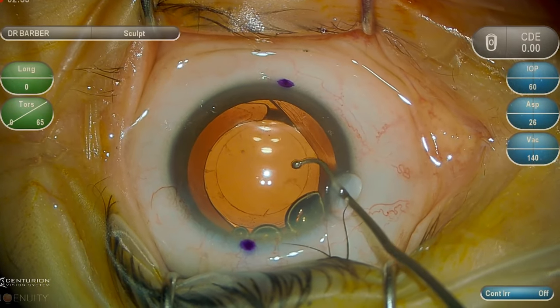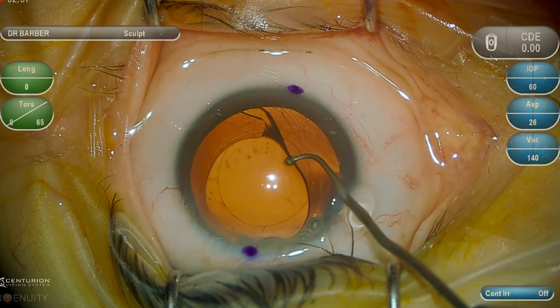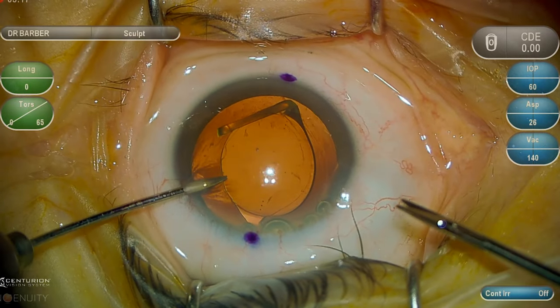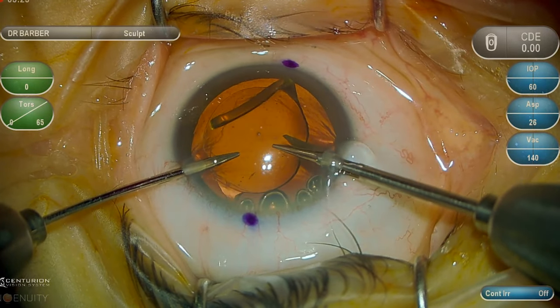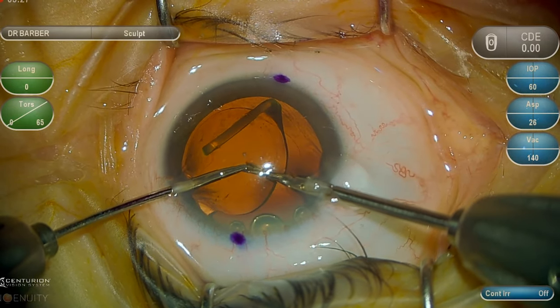Once adequate viscoelastic has been injected both posterior and anterior to the lens implant, the lens implant is elevated into the anterior chamber. This technique involves cutting the lens implant nearly in half using micro forceps and micro scissors, going 90 percent across the surface area of the optic.